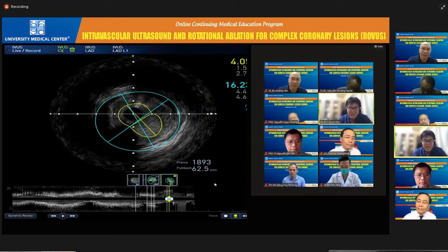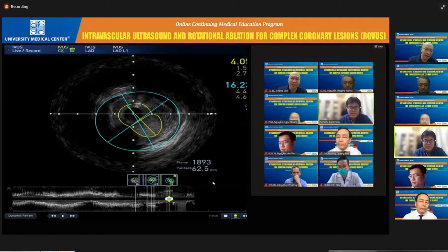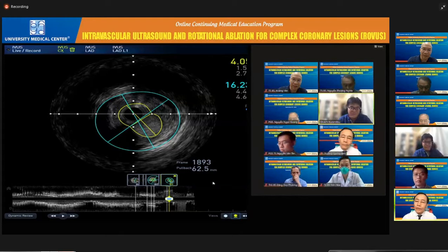According to the current expert document, when the IVUS shows the MLA is 4.5 to 6.0, we should measure FFR to assess the functional significance. However, when the MLA is over 6.0, we can defer the revascularization. So in this case, once again, the MLA is 4.0, so that's why the region is significant based on the IVUS finding. Thank you, Dr. Kuramitsu. I agree with you.